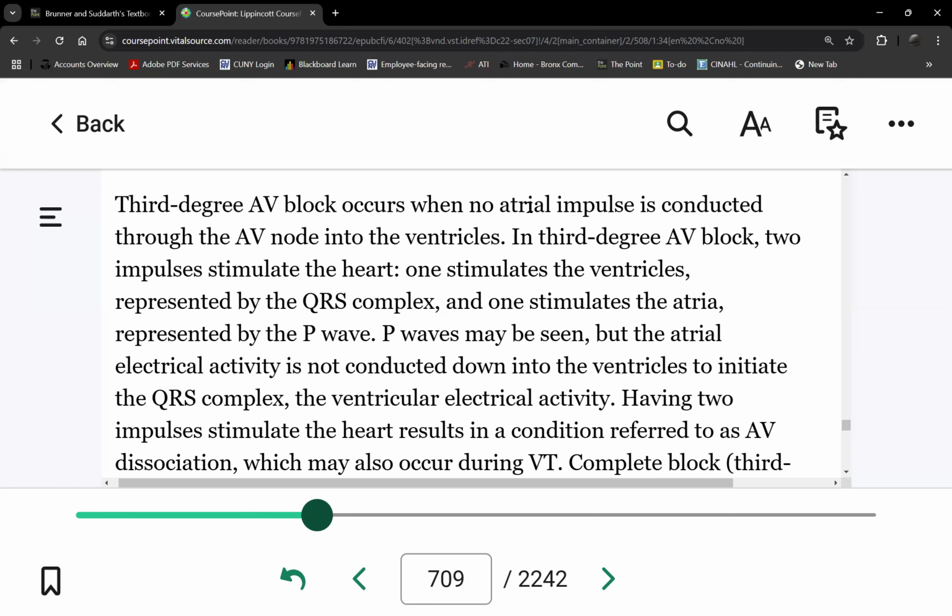So in case you assess a patient and they're on the monitor, and you think, how come I'm seeing pacemaker spikes, but you don't feel any implant? They probably have a leadless type. So modern pacemakers are leadless. Again, who chooses it? Of course, it's the cardiac electrophysiology specialist. They will choose whether you're a candidate for leadless or a regular pacemaker. Any questions about the three?